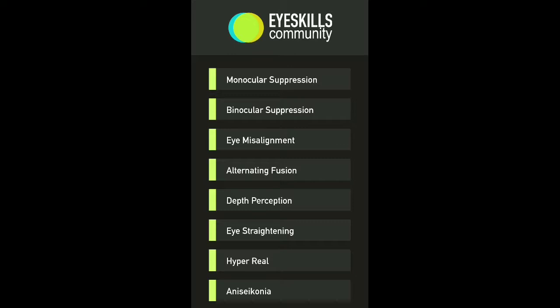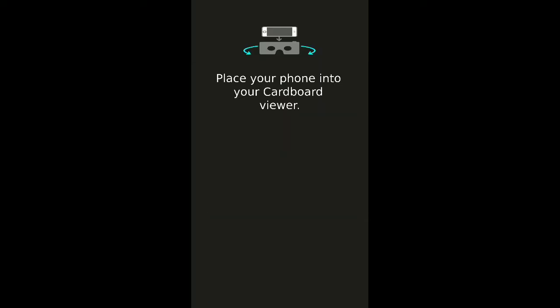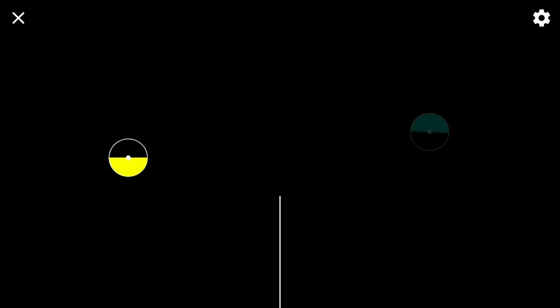Let's go down to, give myself a bit of volume so I can hear where we are. Misalignment measurement. So in the misalignment measurement, if we press E to go into that, right eye is strabismic. You should be able to choose which eye is strabismic by holding down long left or right. Left eye is strabismic. So again, A and D on the keyboard, you can pick which eye is strabismic. In this case, the left eye is strabismic, and we've slightly suppressed the luminance for the right eye. So you pick a position, for example, esotropic or exotropic. Just go for esotropic, and just press E again.